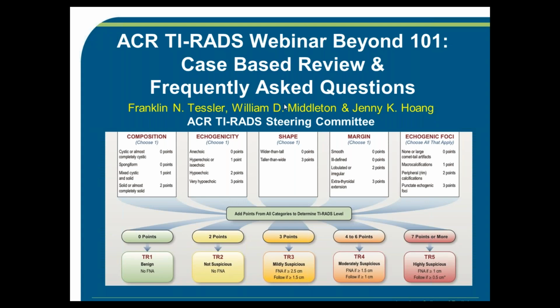Hi, everybody. Thank you for joining us today for the second ACR TI-RADS webinar. This is Beyond 101. We're going to be doing frequently asked questions, and a lot of those questions will be case-based. My name is Jenny Hong, and I'll be moderating and presenting. I'm a neuroradiologist at Duke University Medical Center.